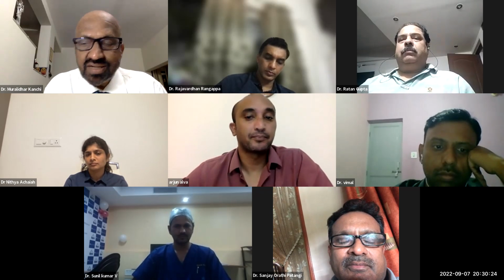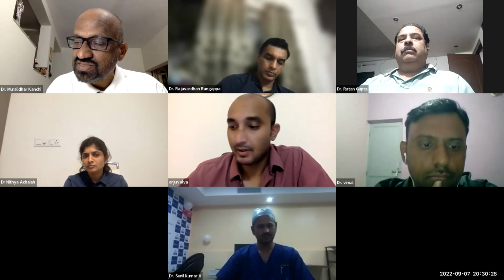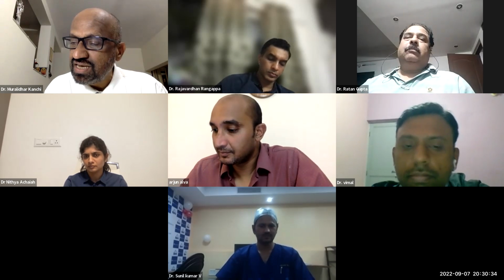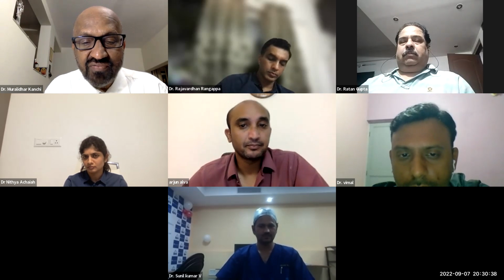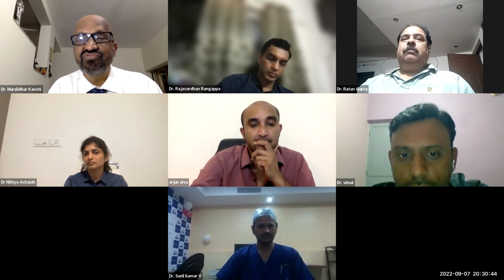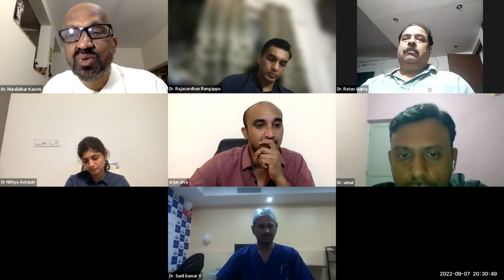Okay, I would like to ask Vimal, it's a question which always is in my mind. When you target the SpO2 on VV ECMO, we say that 85 to 92 is okay. But when we ordinarily ventilate patients, anything below 95 or 92, we get worried. So why is this difference between the requirements in VV ECMO vis-a-vis the other situations?